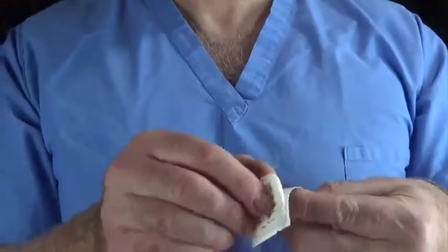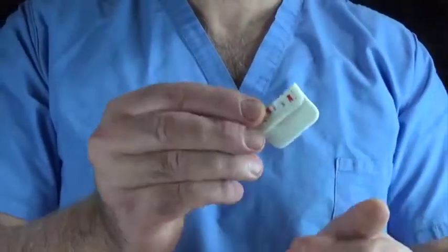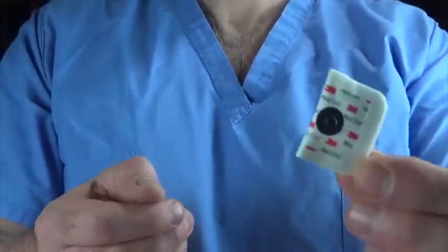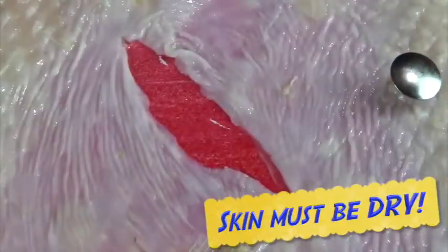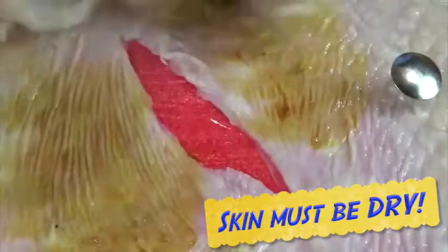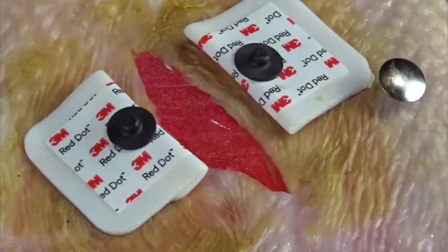For very high tension tears, you can take some of those super sticky cardiac monitor stickers and fold them over about a third of the way like this. Once the wound's been cleaned, you've got to dry the skin along the margins really well with alcohol preps and benzoin if you have it. Once it's dried completely, apply the stickers like this.